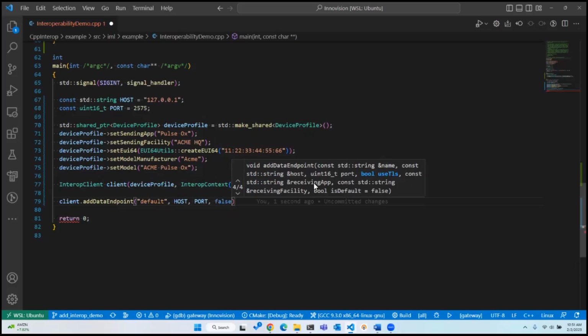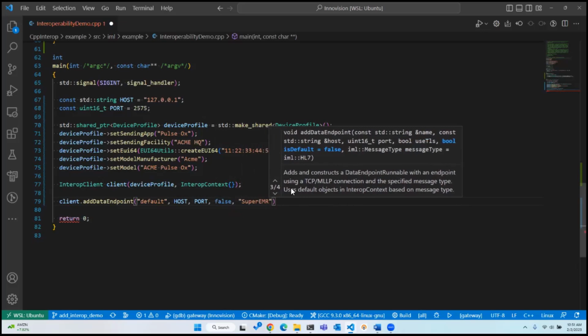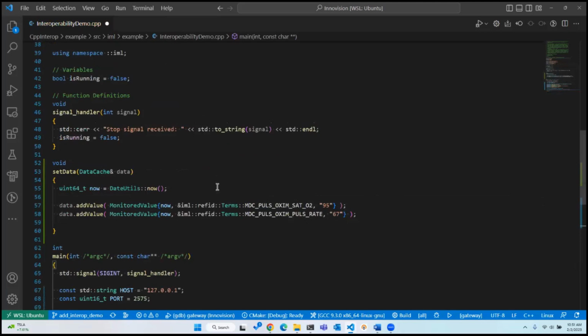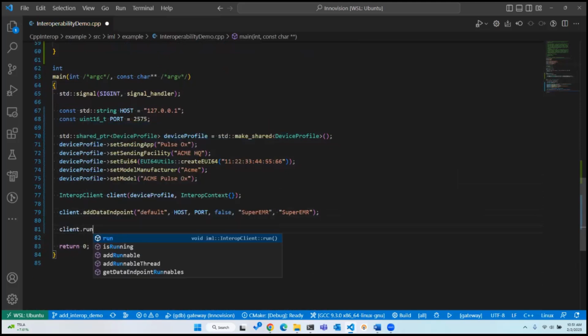I also need a receiving app and a receiving facility because I'm going to be sending our data in HL7. In this case, that's just going to be the super EMR for the receiving application. I'm going to name the receiving facility to be the super EMR as well. Okay, so just to recap, we have created the data that we're going to send to the super EMR from our Acme pulse ox. I've defined my device profile, so this is who I am. I created a client and added a data endpoint to it so that I can actually send the data. So the next thing to do is to just run the client.